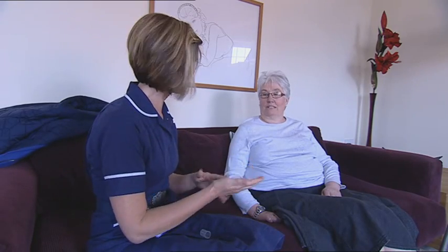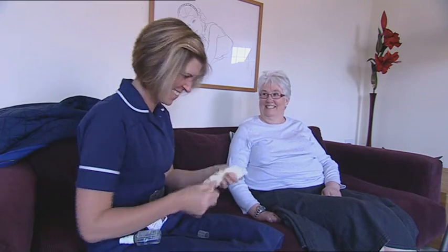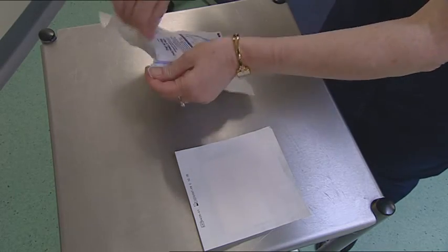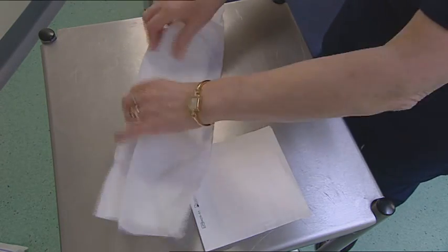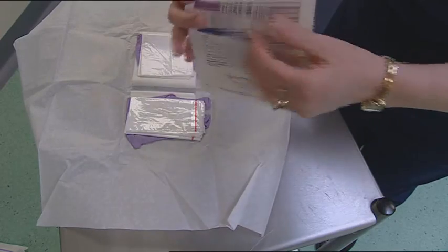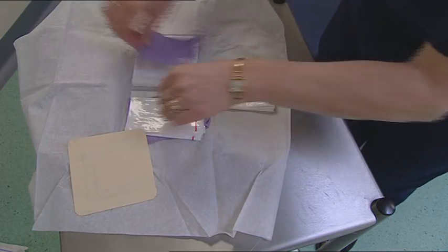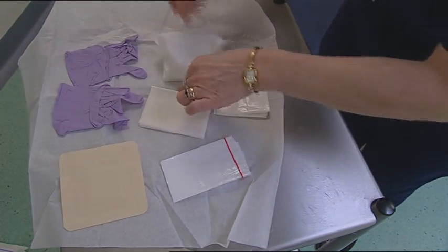This nurse has given her hands a quick rub with alcohol gel, but she hasn't cleaned them thoroughly enough. Also, her gloves may not be clean. There are 3 problems here. The contents of the dressing pack are being touched by a bare hand. The key part, the sterile dressing, is being handled. And thirdly, the healthcare worker is not bare below the elbows. It's important to remember that it's not safe to touch key parts, even when you're wearing gloves.